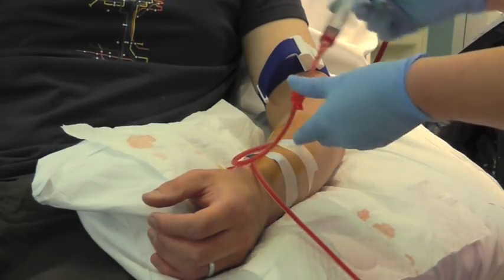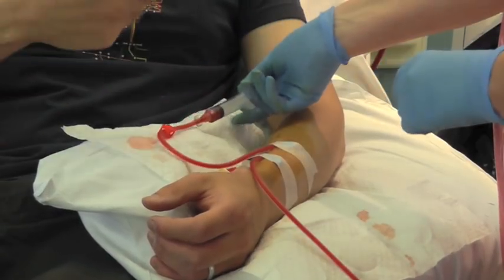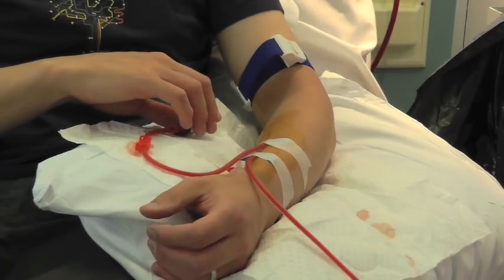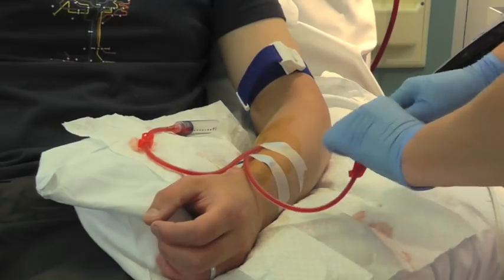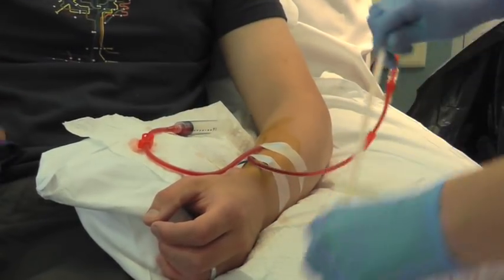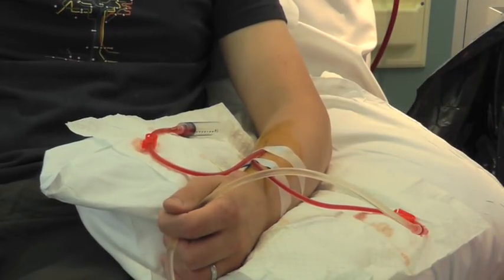After flushing the venous needle we always leave the syringe connected to the needle just so the patient doesn't connect up the wrong way around. You will notice on this video that one of our patients uses a tourniquet. When the buttonhole tract is formed you will not really need to use a tourniquet.